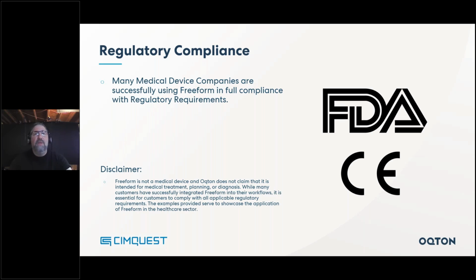So if you're going to be doing regulated work, if you're going to be doing anything with regulation, Freeform will work for you. Without getting into the details, as long as it's validated as off-the-shelf software, that's how many of the world's leading medical device companies are using Freeform with full compliance. We might not be regulatory experts, but if you have any questions, please feel free to reach out and we can point you in the right direction.